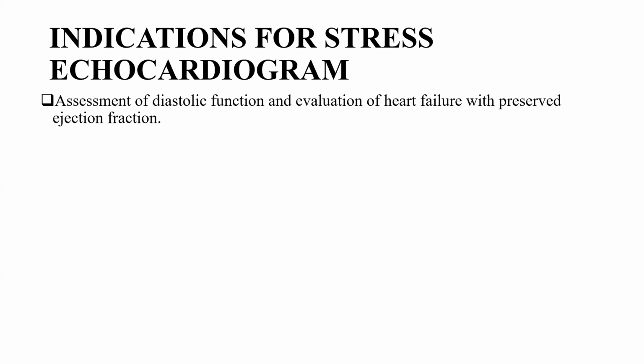So in diagnosing HFpEF at rest, you may have your left atrial pressure being normal based on echo, E over E prime maybe less than 14 at rest, even though the criteria for HFpEF says to look at E over E prime greater than 9 as part of the inclusion criteria, but most of them may not demonstrate evidence of increased left atrial pressure as assessed by tissue Doppler at rest. So you may want to stress, and during the stress, evaluate the diastolic function to see whether it increases with stress.